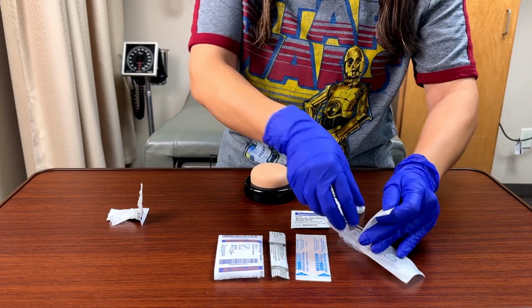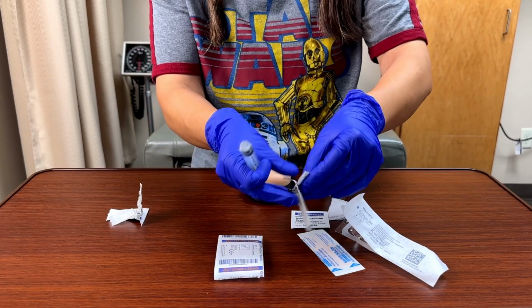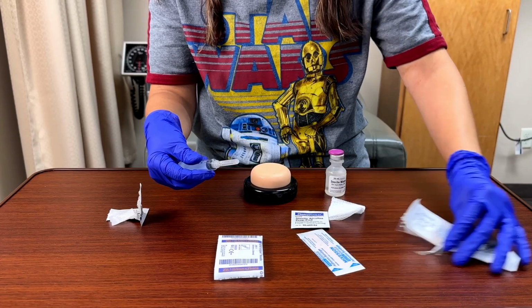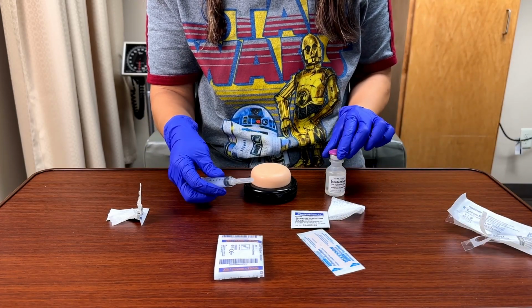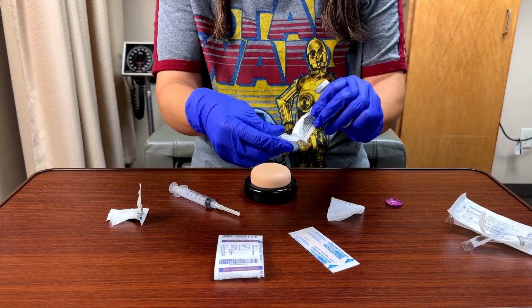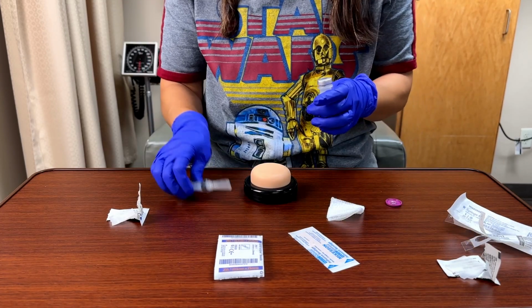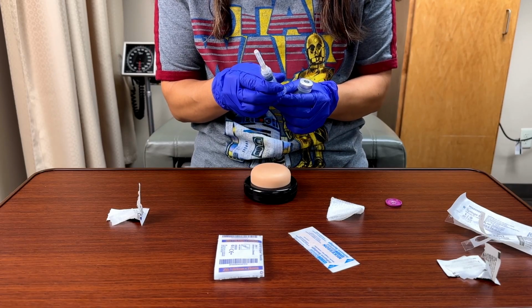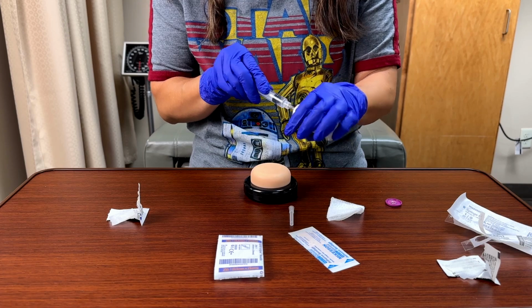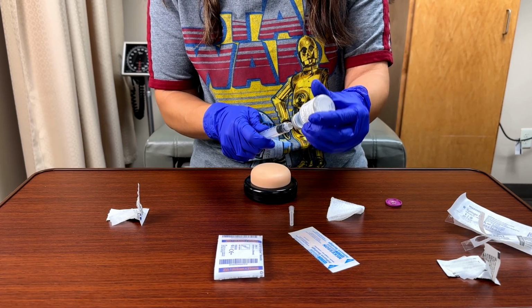Now we're going to draw up our medication. I already showed you how to do this, but I'm going to show you one more time. I'm going to put my drawing needle on. Remember, I'm not going to take it out of the packaging. Then I'm going to open up my medication and wipe this down so it's ready to go. I'm going to be injecting 1 cc, so I'm going to pull up that air, take this off, and put that 1 cc of air in, and then withdraw the medication.